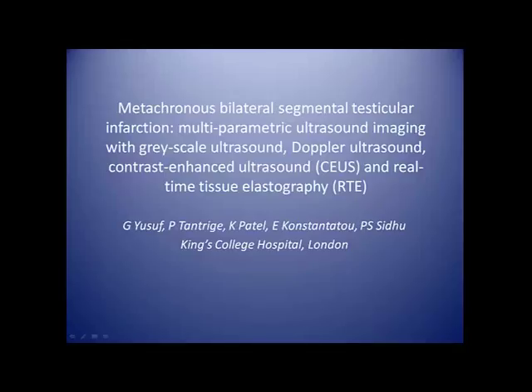Metacronous bilateral segmental testicular infarction. Multiparametric ultrasound imaging with grayscale ultrasound, Doppler ultrasound, contrast-enhanced ultrasound and real-time tissue elastography. Presented at British Medical Ultrasound Society meeting, Manchester 2014.